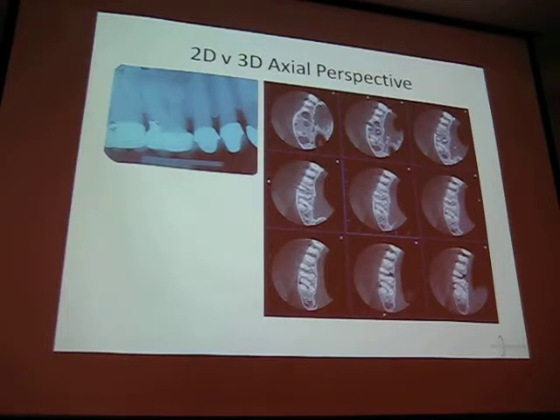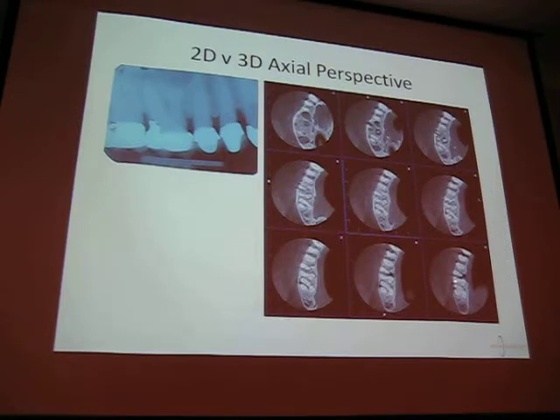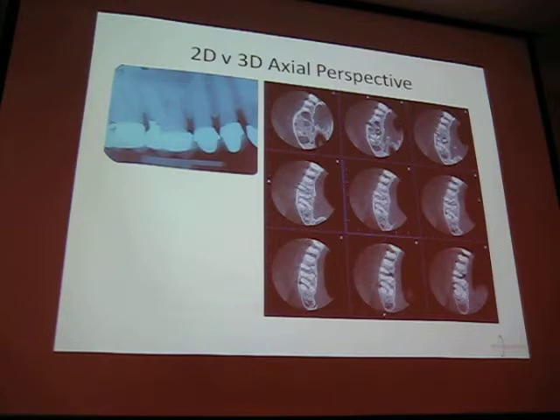What I like — I'll show you the axial view, going in from the top down. Because it's rare when you are doing surgery in slices going mesial-distal. You're coming in apical. So why not take a look right from the pulp chamber and start going down, and let's see at which point we start seeing that lesion and how far it extends. Those different views, these different tools — it's really powerful.